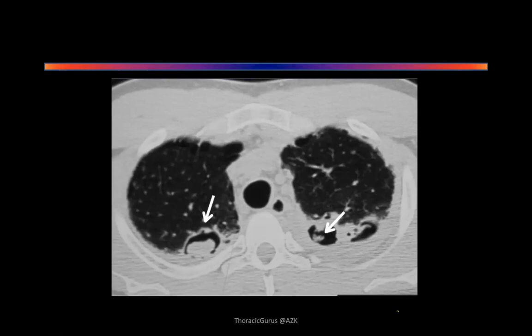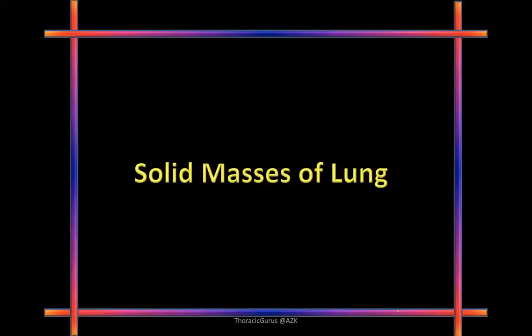Sir, a CT scan of the chest with no identifiers. We are looking at the lung window, and we have bilateral thick walled cavity lesions with soft tissue lesions within the cavities, sir. Classical bilateral aspergillomas with the surrounding lung. The cavity has consolidatory changes with some healed fibrotic lesions, sir. Fibrosis as well. So, what is your description leading to? You described it beautifully. Bilateral. In what? Could be tuberculous cavity, which is second. In post-TB. Beautifully, Ramaswamy. So this could be bilateral aspergilloma and previously tuberculous cavity. Yes. Okay, that's what I want you to say. You described it, but you have to come out with the diagnosis. Okay. Yes. Good. Thank you, sir.